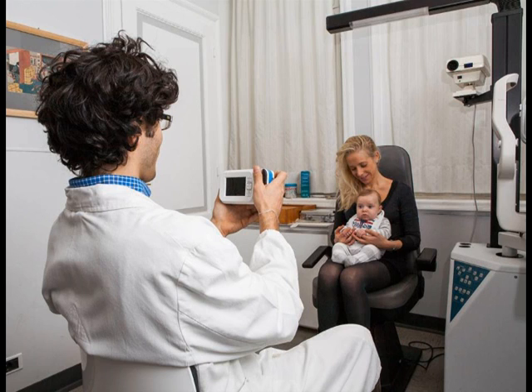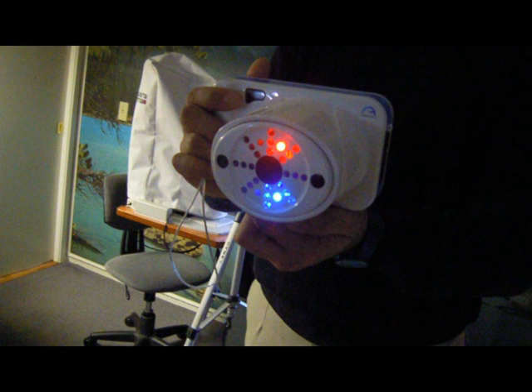To refract infants, young children, and any non-cooperative patients, please turn the audible and/or the vision fixation targets on. These lights and chimes will attract their attention and ensure they look towards the center of the camera.